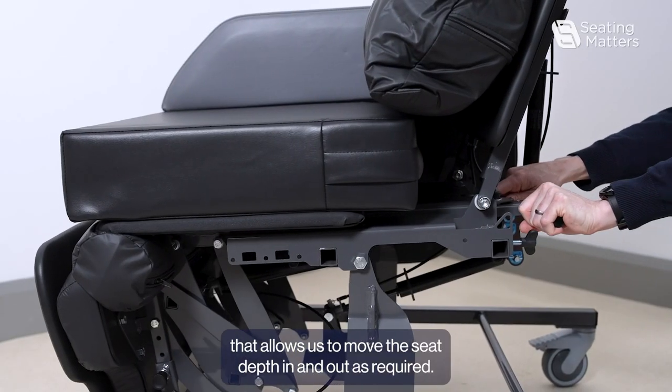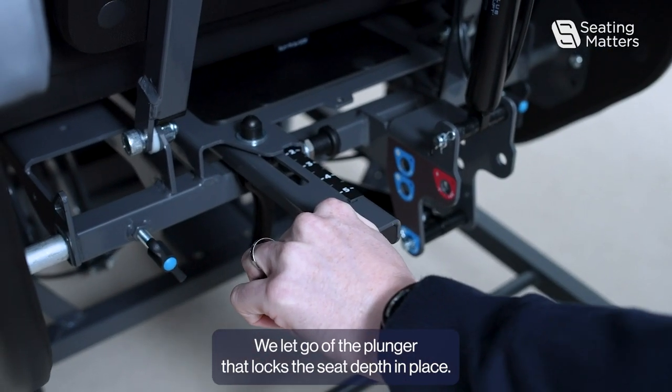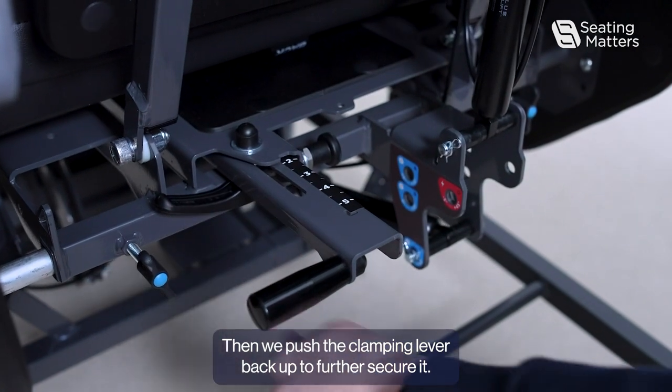That allows you to move the seat depth in and out as required. Let go of the plunger to lock the seat depth in place, then push the clamping lever back up to further secure it.